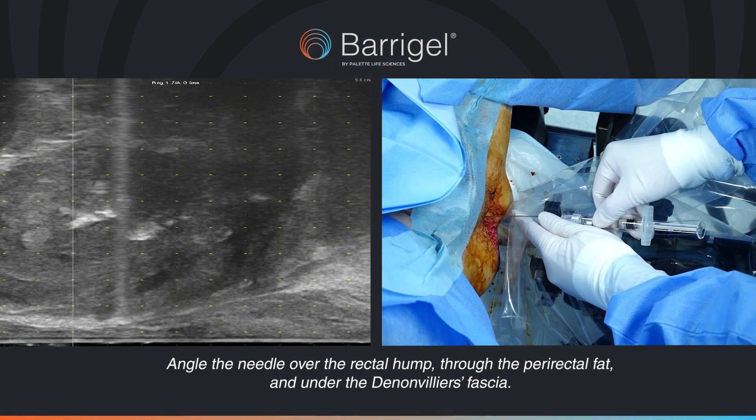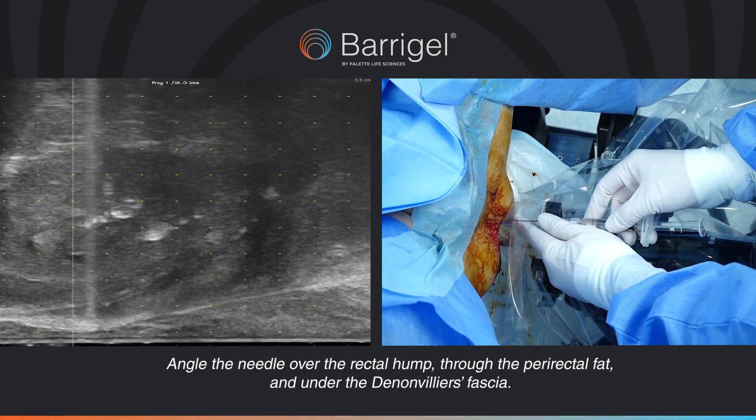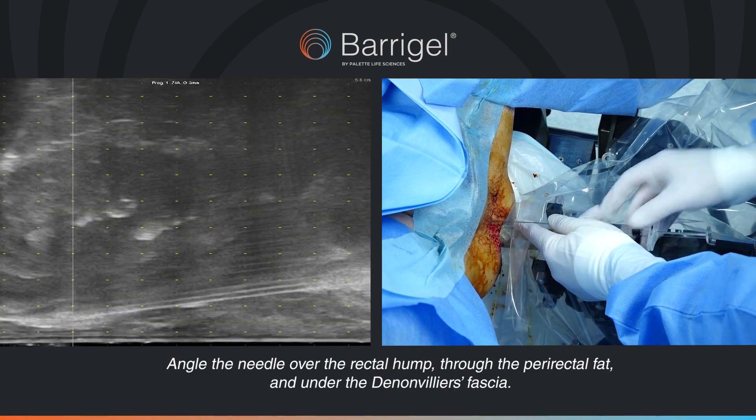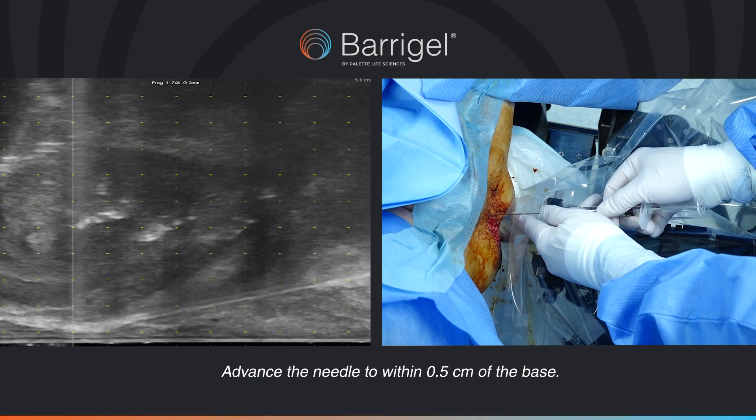Angle the needle over the rectal hump, through the perirectal fat and under the Denonvilliers' fascia. Advance the needle to within 0.5 cm of the base.